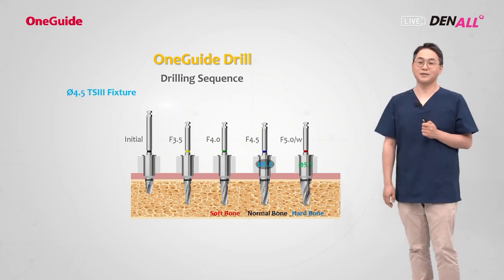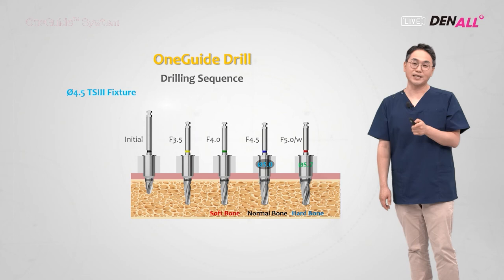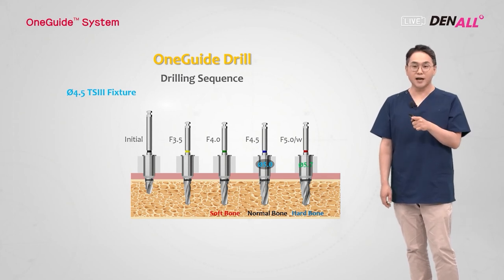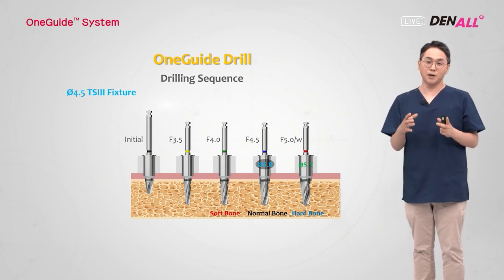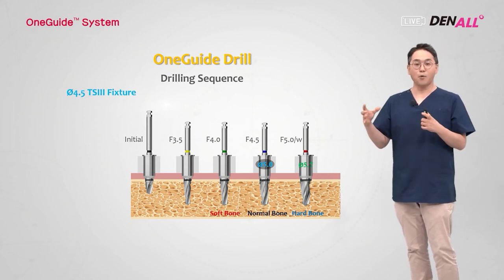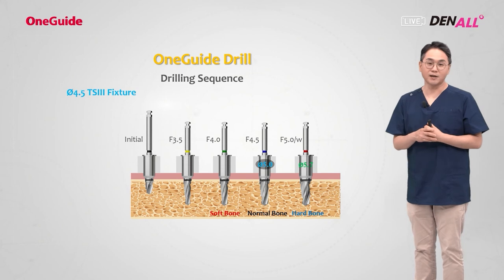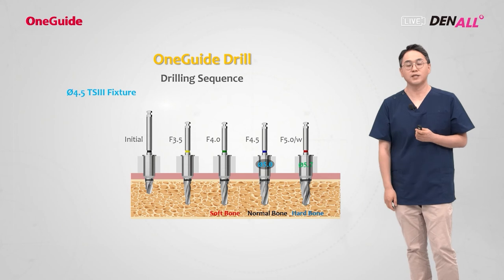Now, it's a little tricky when we place a 4.5 implant. Initial drill followed by 3.5 and up to 4.5 in normal bone. In soft bone, up to 4.0 is used, but hard bone is problematic. To do oversized drilling, you may think a 5.0 drill can be used, but a 5.0 drill is for a 5.0 implant, so the guide barrel is 5.7, fitting the wide guide hole. If you plan the 4.5 implant, a 5.1 millimeter guide hole is made, so the barrel size does not fit into it. How can you place a 4.5 diameter implant in hard bone?